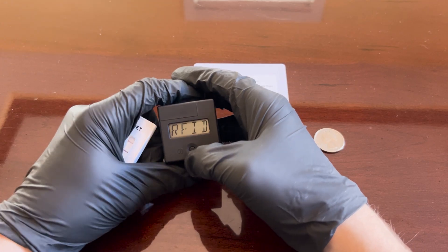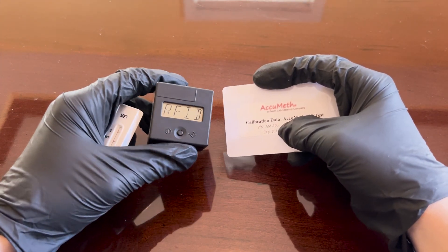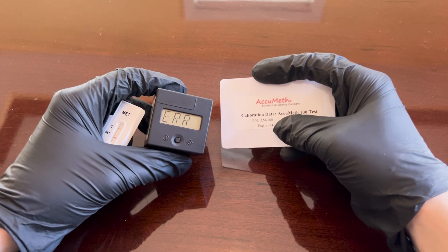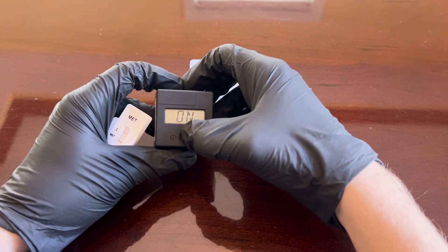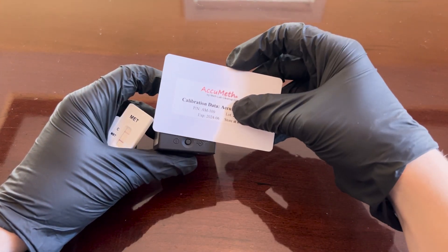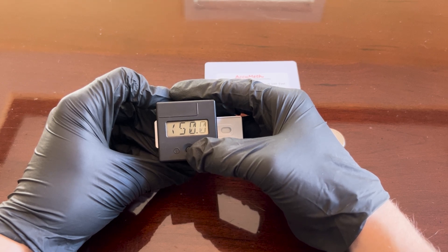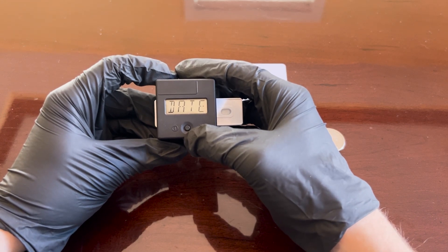For troubleshooting, there are two main potential errors that could come up while using the device. The first is the ERR message, where the device cannot properly read the information on the RFID card. Go back through the RFID synchronization process by having the 'RFID' menu shown and tapping the RFID card on the black box, and you shouldn't get the error anymore.